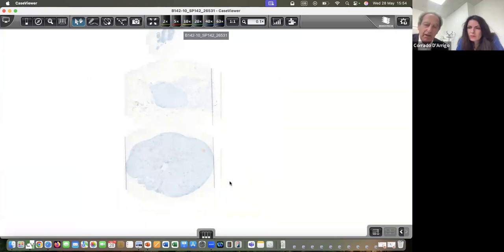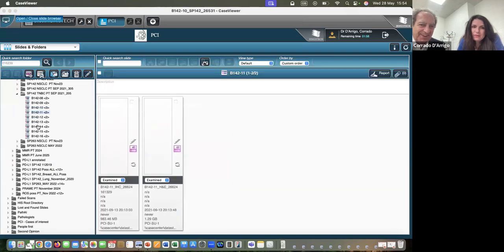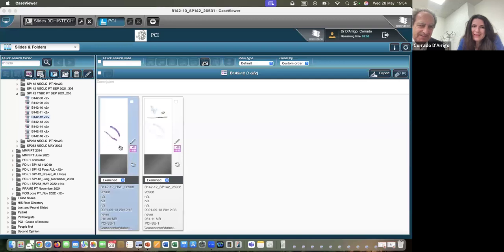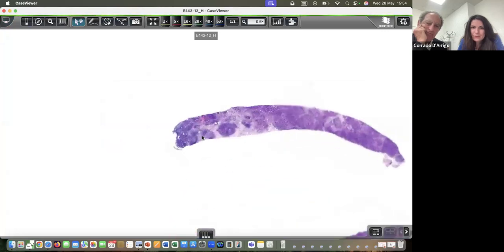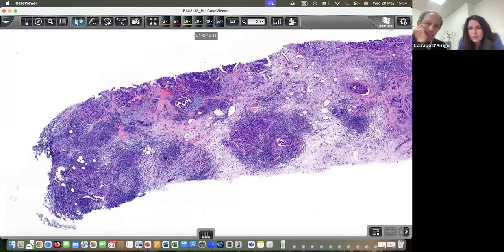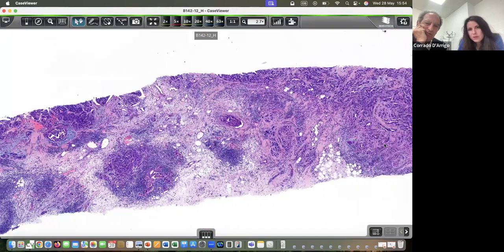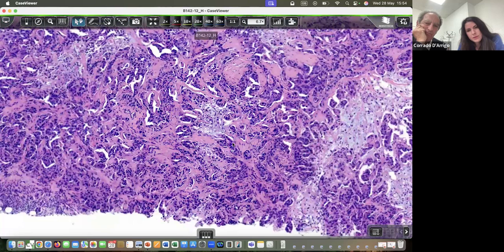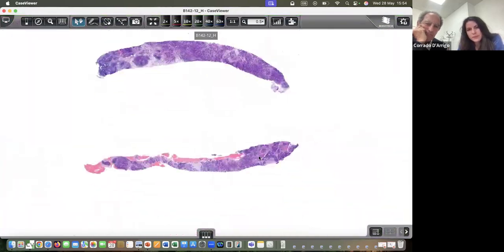And we have 6 more minutes. Do we see another case? Perhaps a core biopsy that is easier? Well, this might be lymph node again, or no? Maybe not. Looks primary. Breast. Yeah. But with heavy lymphoid infiltrate in places. Okay.